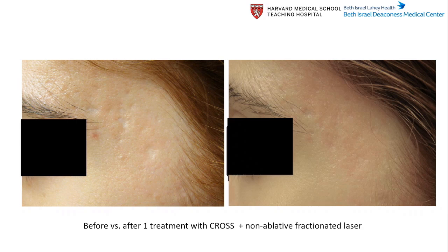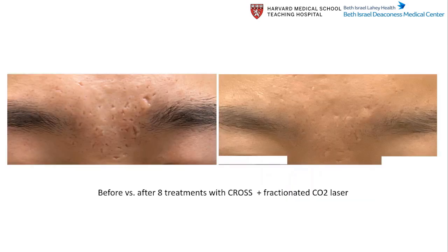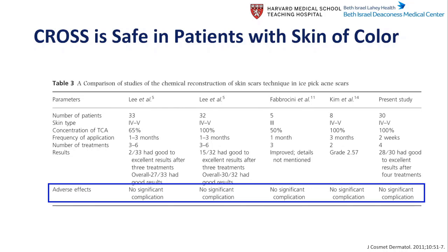This was my patient, after only one session of CROSS and fractional 1540. This was a photo after CROSS and picosecond laser fractional technology. My Asian patient had very severe ice pick scars and multiple boxcar scars, and I combined fractional CO2 and CROSS during the same visit. So you might question if CROSS is really safe for skin of color patients. The existing literature is very reassuring, with no significant complications in skin of color patients.